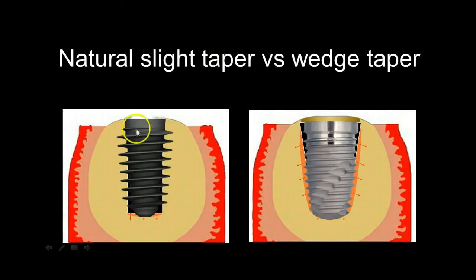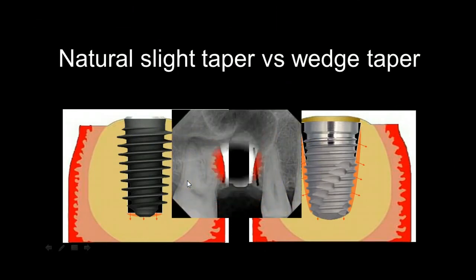So again, don't just look at the macro design of the implant. Look at what you're engaging as well. Look at the width of the threads versus these type of threads. Much bigger difference, much bigger outcome in the stability. And here, this is almost like a visual tolerance. Look, here's a 6.5 by 8.5 implant in the posterior maxilla.